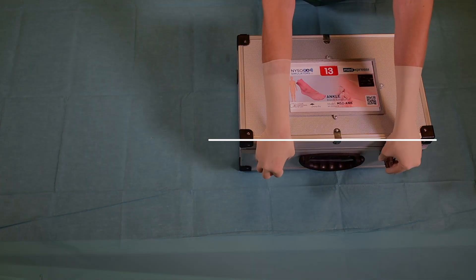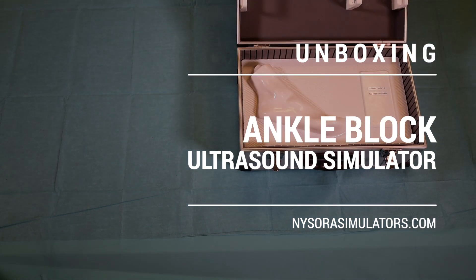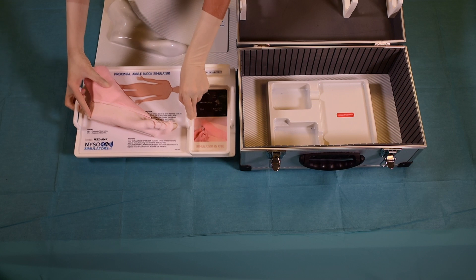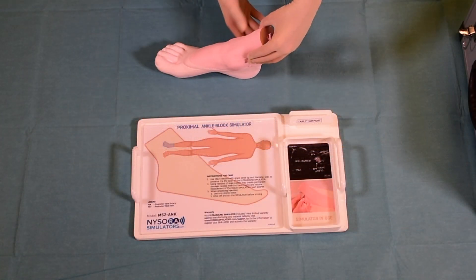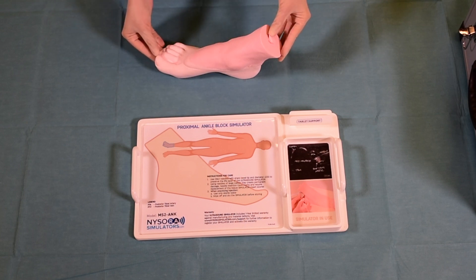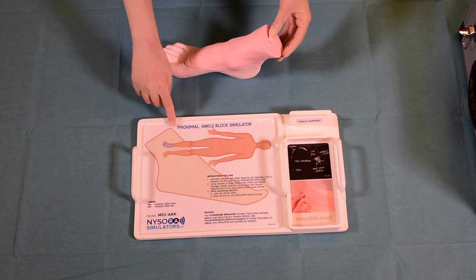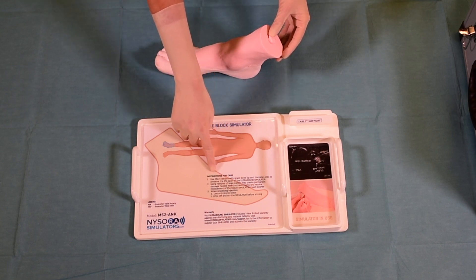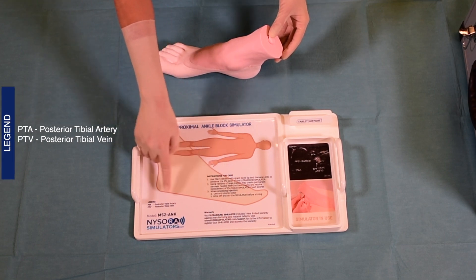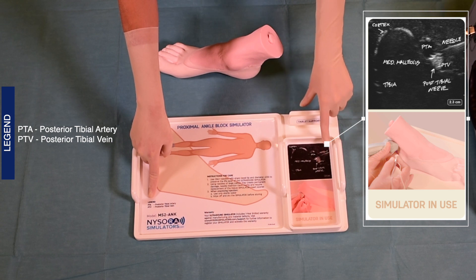The ankle block ultrasound simulator, like all Nysora simulators, is delivered in a custom-built box that is convenient for both care and storage. On the tray there are clear labels as to which part of the body the simulator belongs to. Clear instructions for use are also provided, and all anatomical landmarks featured are printed on the label accompanying the tray. The abbreviations are visibly labeled and featured on both the ultrasound image obtainable from the simulator as well as on the tray.